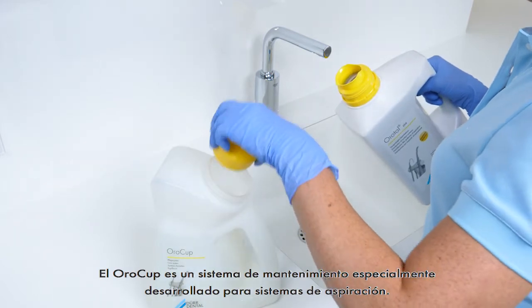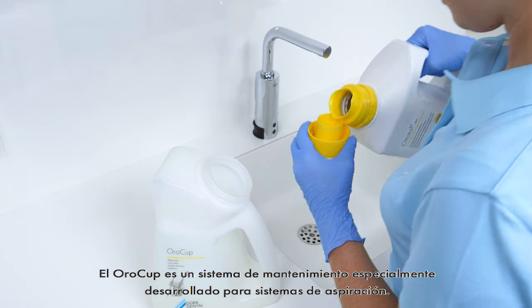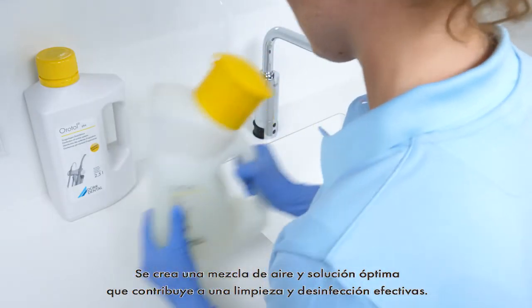The OroCup is a care system specially developed for suction systems. It creates an ideal air-solution mixture which contributes to effective cleaning and disinfection.